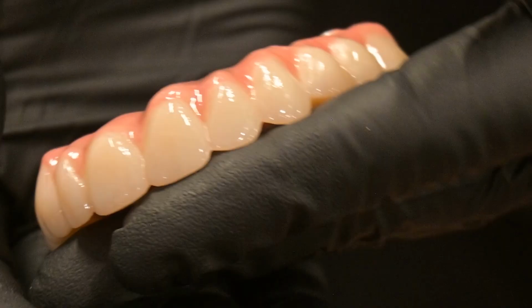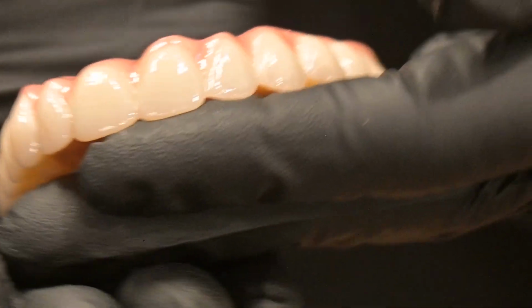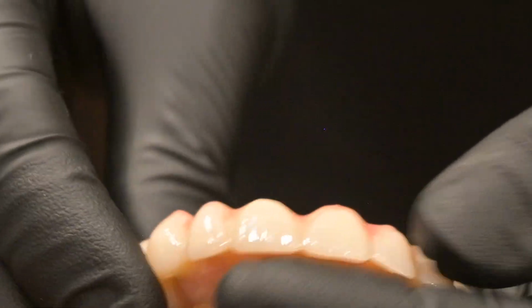Well, this is based on the patient's own habits, biology, bone, and biomechanics. So we do a full assessment of the patient's bone, gums, and features, and we try to determine the ideal position of those implants, and then we can determine the number of implants that we're going to be placing in each case.